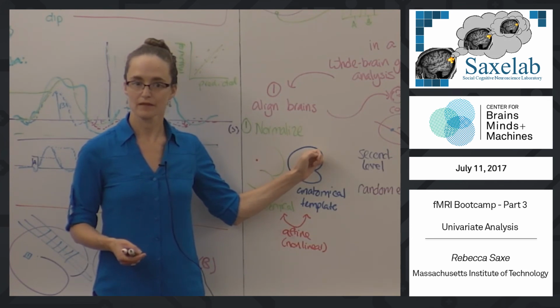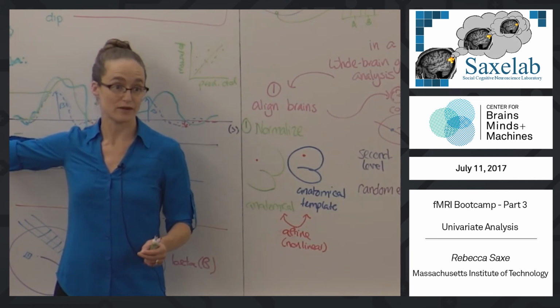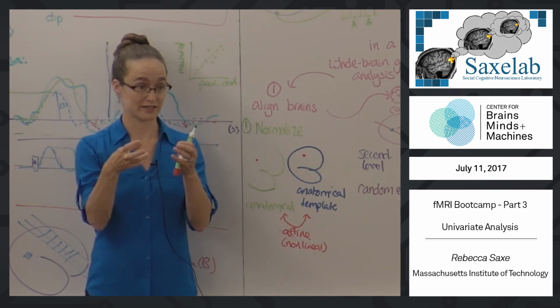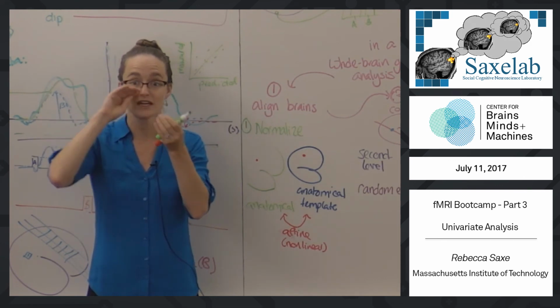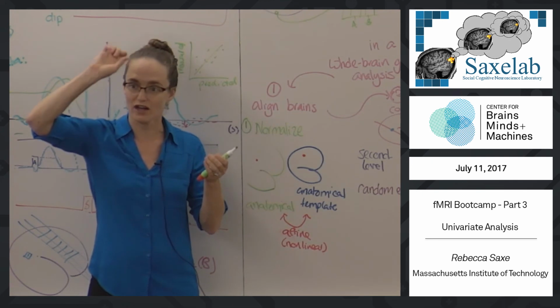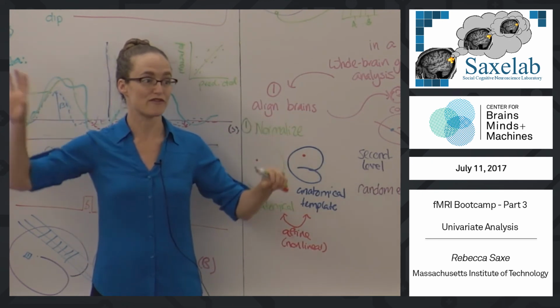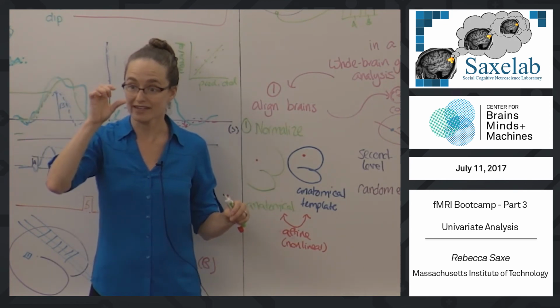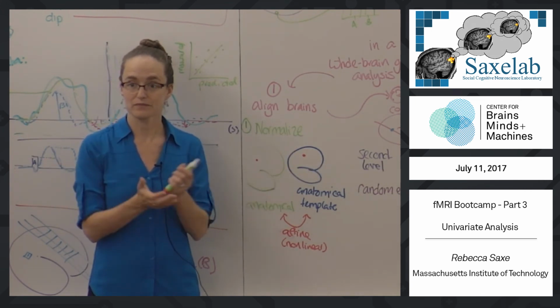image. And that is using the really high spatial resolution that can show you the difference between the cortex and the white matter, the structure inside the subcortex, the boundary between the brain and the pial matter, right? All those dark and light boundaries in the image, right? Every time you cross a tissue boundary, the brightness changes. That's what you're trying to map. And so the fact that this is very high spatial resolution and very good quality is critical to making this a really good fit.